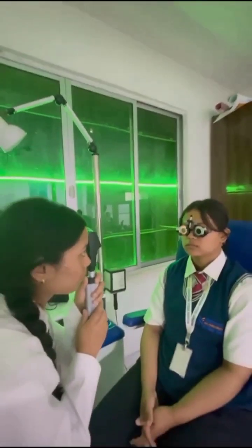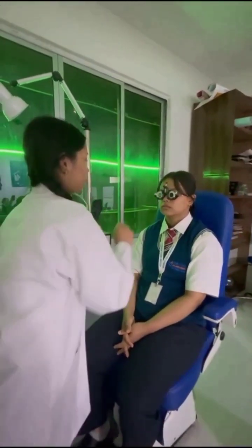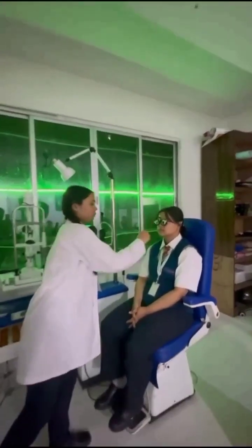Now I'm seeing no movement of the reflex, which means her eye is neutralized. Now she can read this very easily.